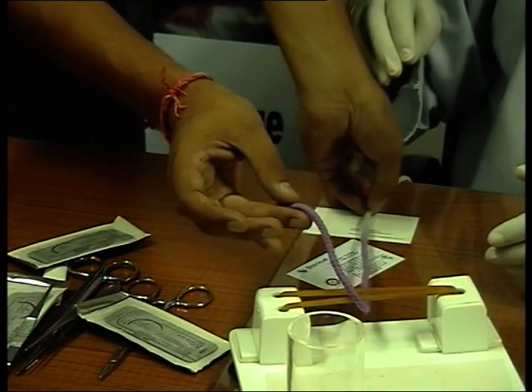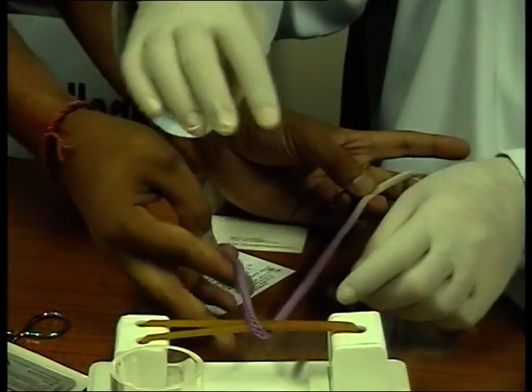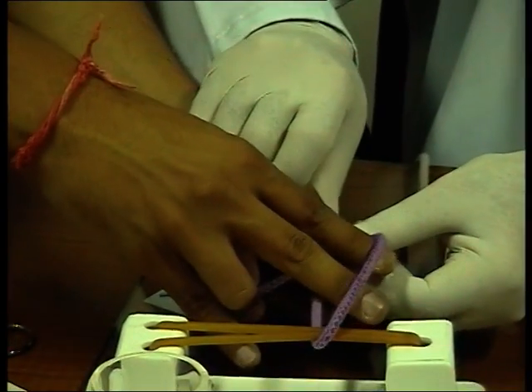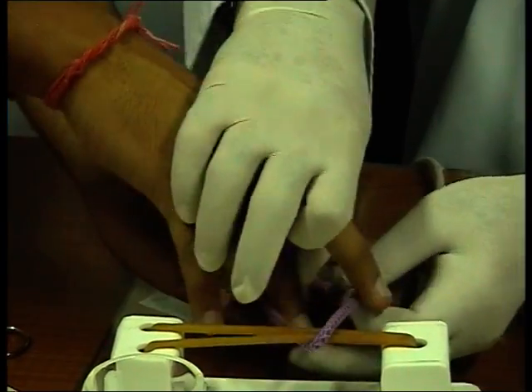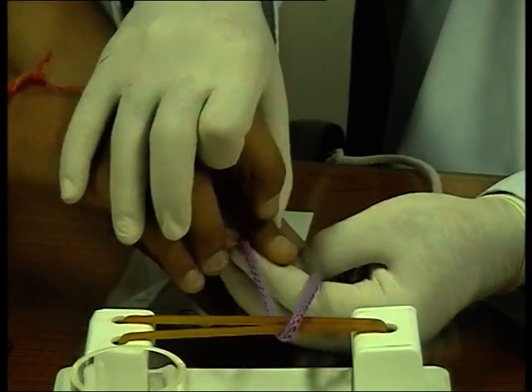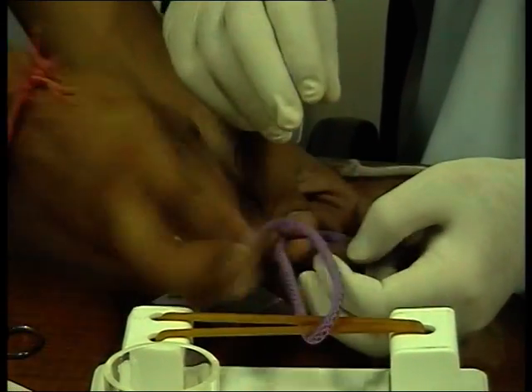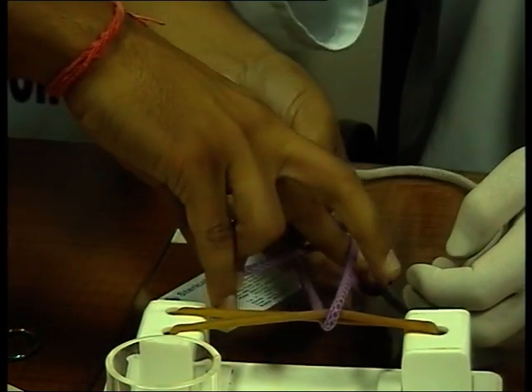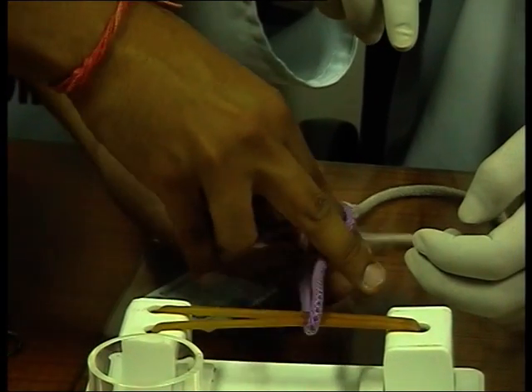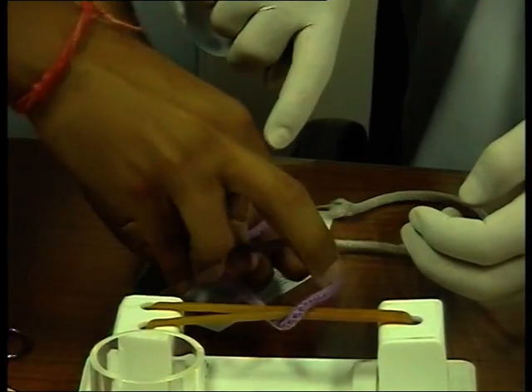Anyways, with the ring and thumb. Right. No problem. Use your index to make a 4. Very good. Now advance this. You're too far away now. You can advance it here. Very good. Now use index through this. Just don't worry. You don't have to worry, but learn it. It's important. Yes. Hold that section. Use index to draw this thread out.